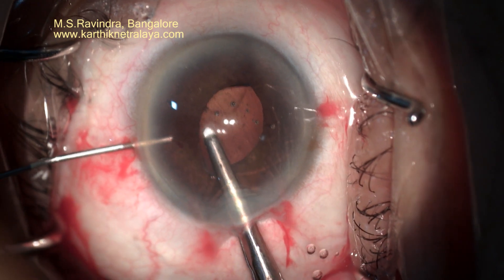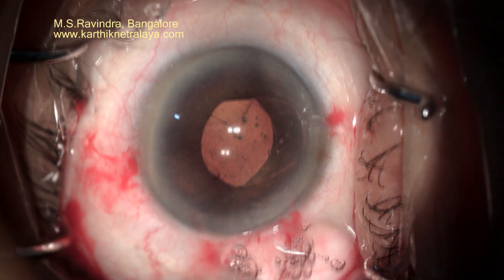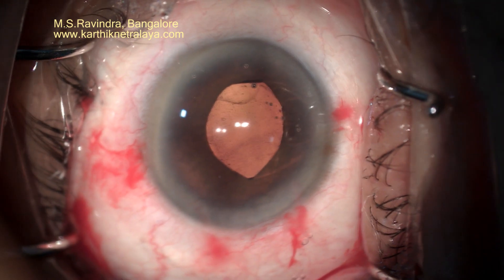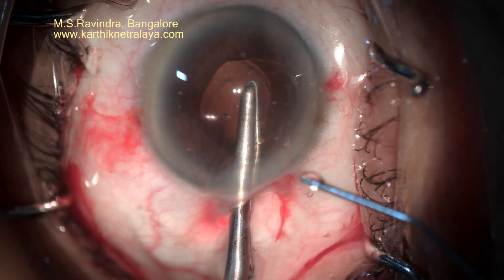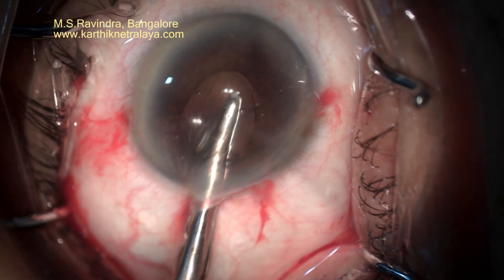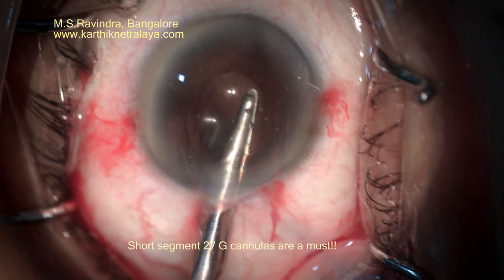A 27-gauge cannula nicely enclavates one haptic, and the anterior chamber is deepened. The IOL is held at the haptic-optic junction to stabilize it and is taken behind the iris. Ideally, the pupil size should be around 3 to 4 mm before you enclavate, and ensure that the optic is in the center of the cornea.